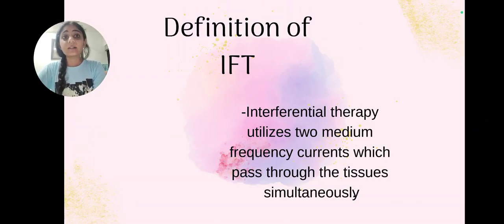So, first, what is the definition of interferential therapy? Interferential therapy utilizes two medium frequency currents which pass through the tissue simultaneously. Means IFT has two different medium frequency currents passing through the skin and tissue.